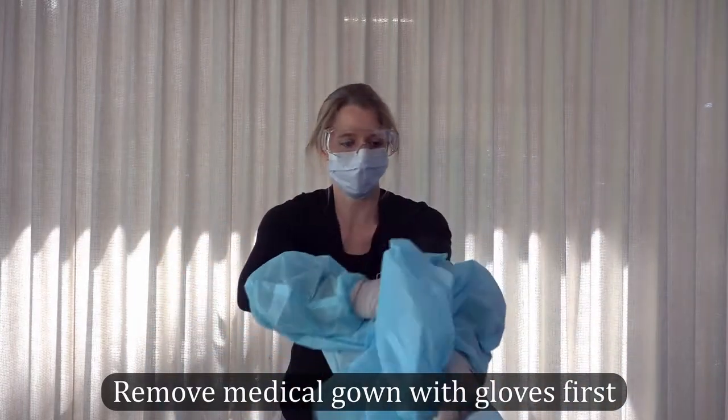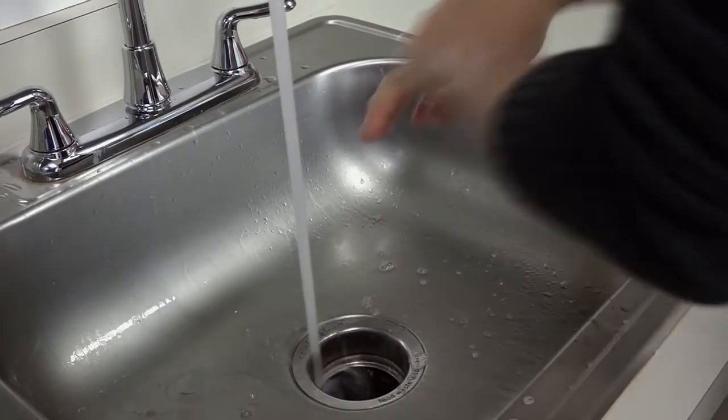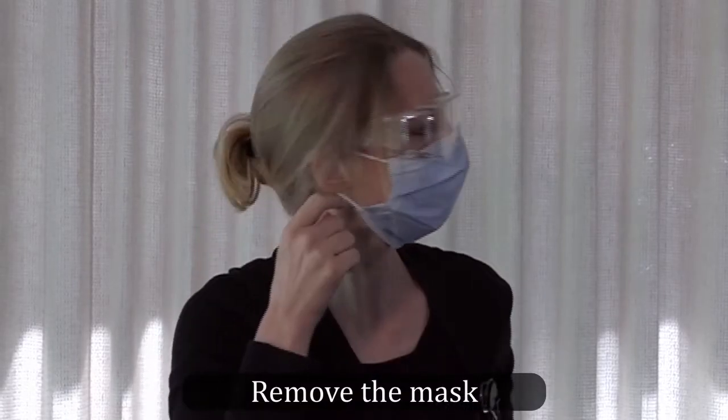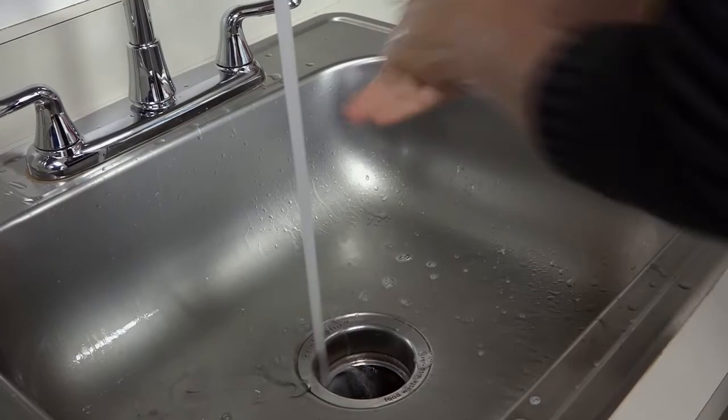After completing those steps, remove PPE in a private area, dispose of it, and thoroughly wash your hands. After this step, wash your hands.